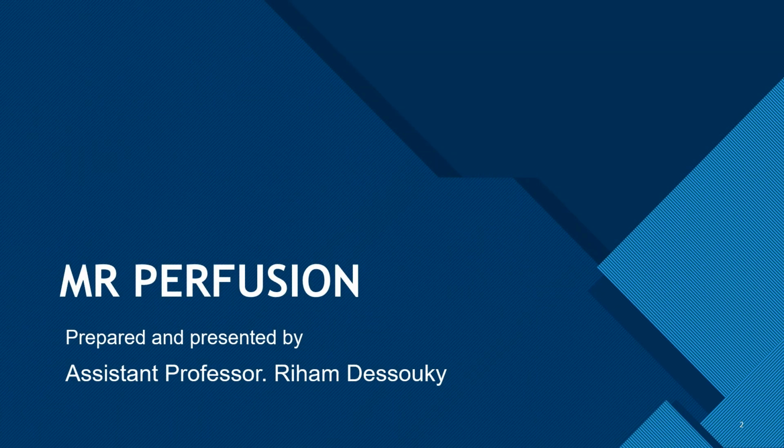I'm an assistant professor of radiology at the Faculty of Medicine, Zagazig University, and today we will be discussing MR perfusion.